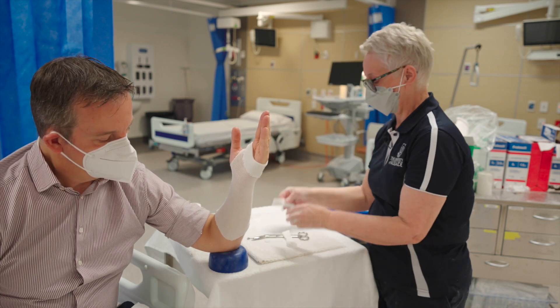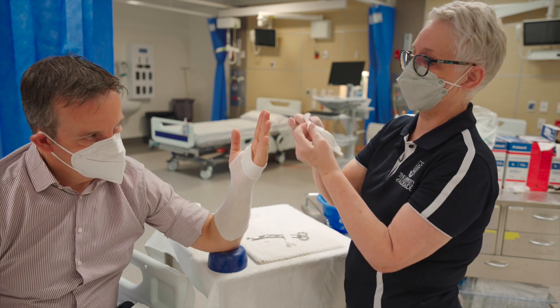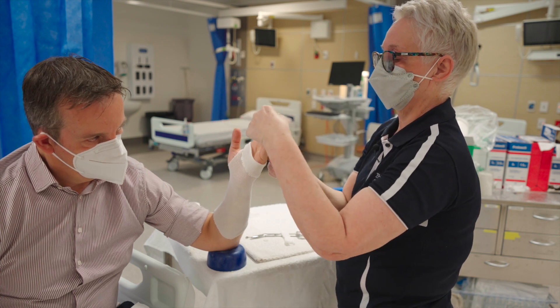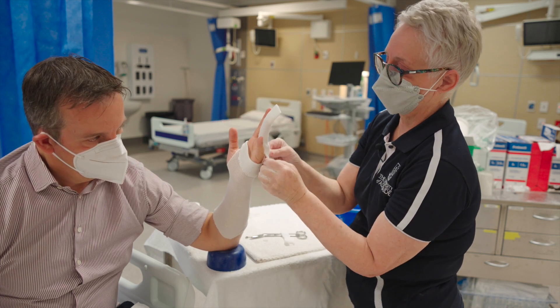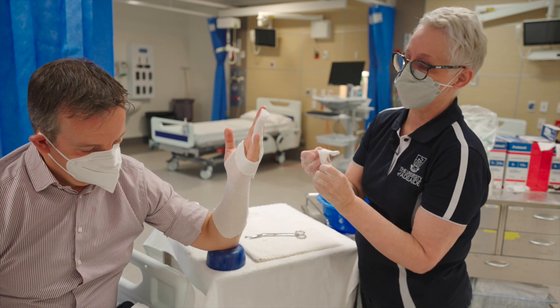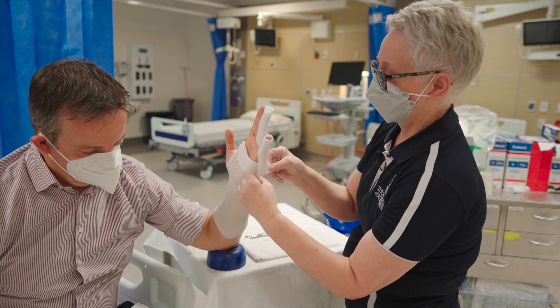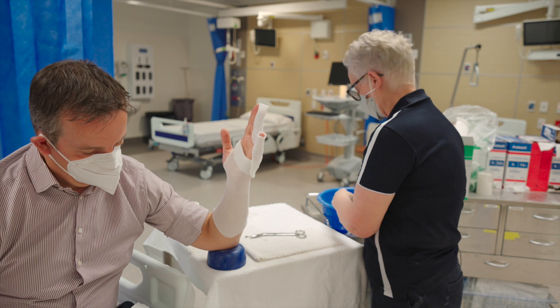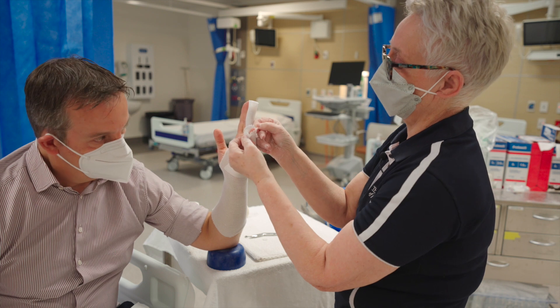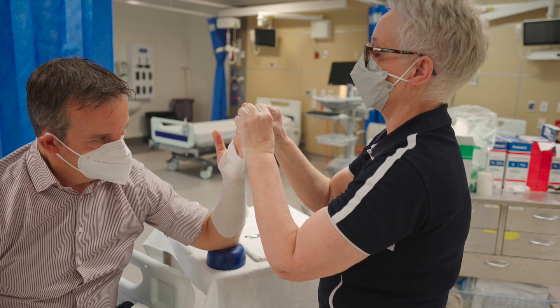Take the next piece of stockinette, which has a small cut so it can slide over the finger spaces. Put these on the correct way — slide it so the longer piece comes over the back of the fingers. Do the same over the other finger. Once those are in place, secure them down with some tape, and bring them down so you can see the fingertips.